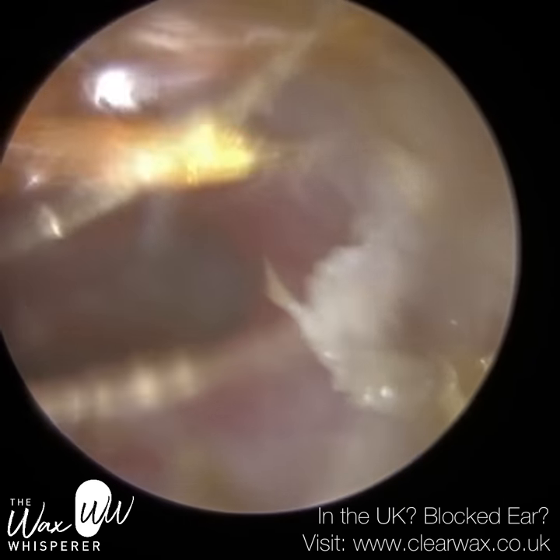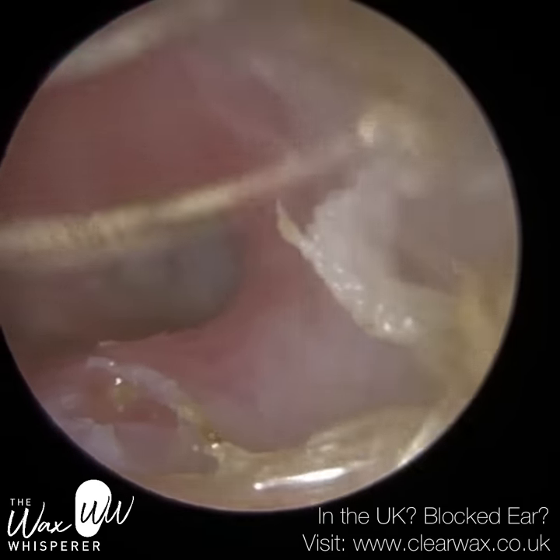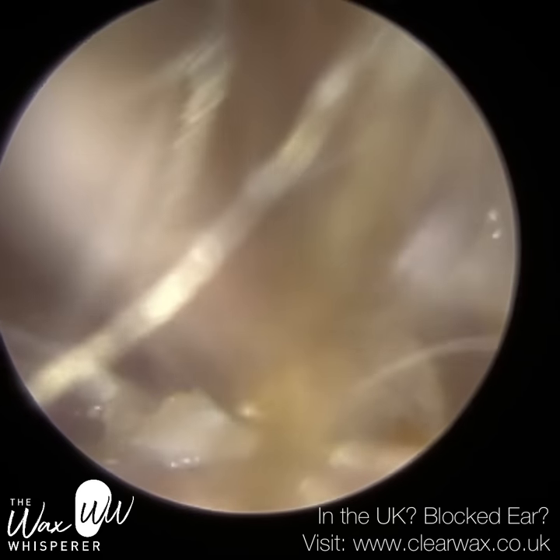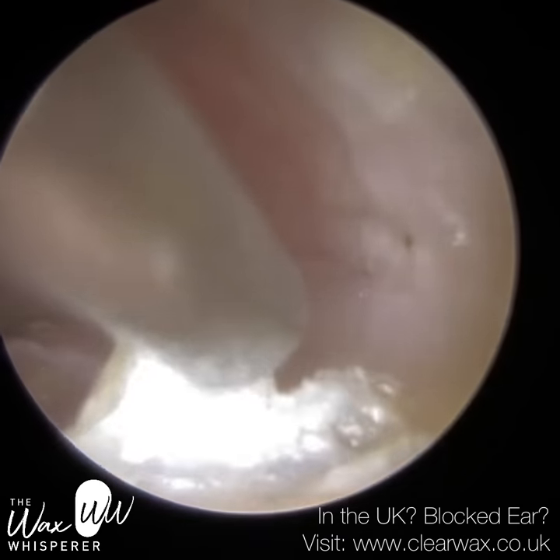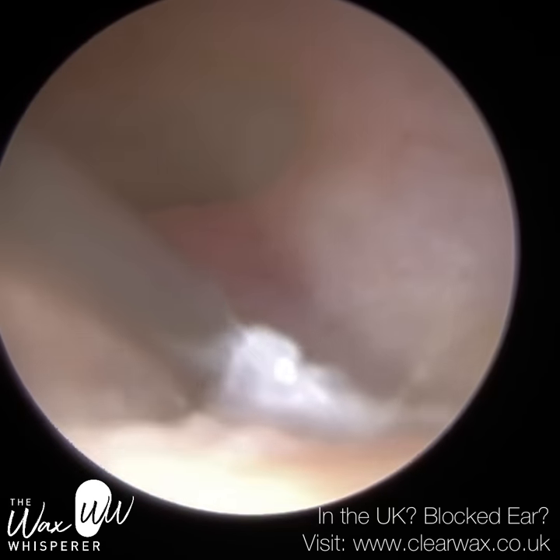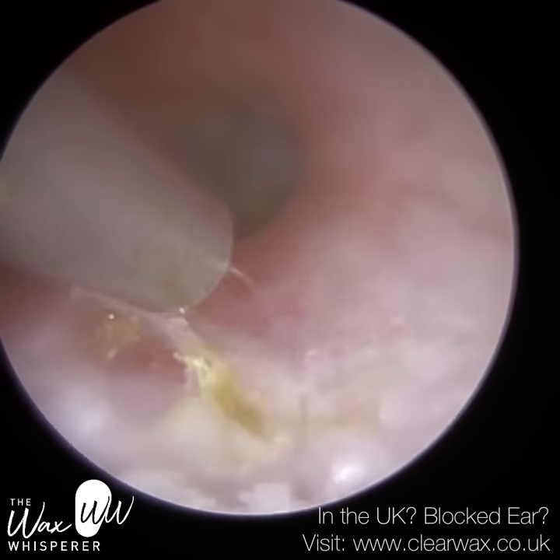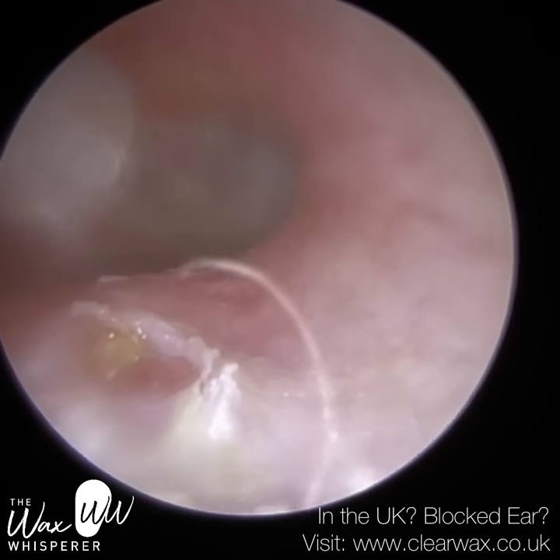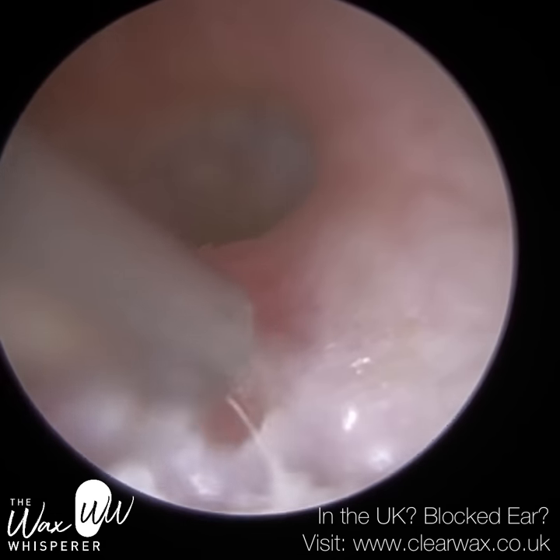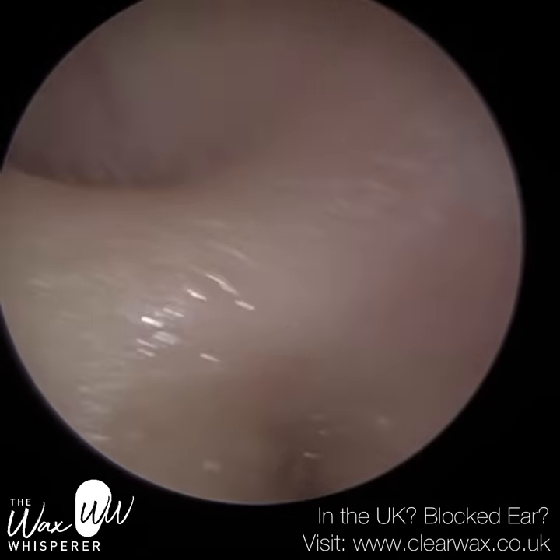You can see the skin — it's quite aged and oxidised. In most cases the skin would migrate out of the ear, but in this particular patient it hasn't — it's just remained on the surface of the canal wall. Skin is quite a difficult thing to remove because it's lining the canal wall, meaning we have to come in close contact with the canal wall itself. On the outer third, the cartilaginous portion, we can apply a bit of pressure. The cartilaginous portion is not as sensitive as the bony part — the inner two-thirds — and cartilage is somewhat semi-flexible in nature.